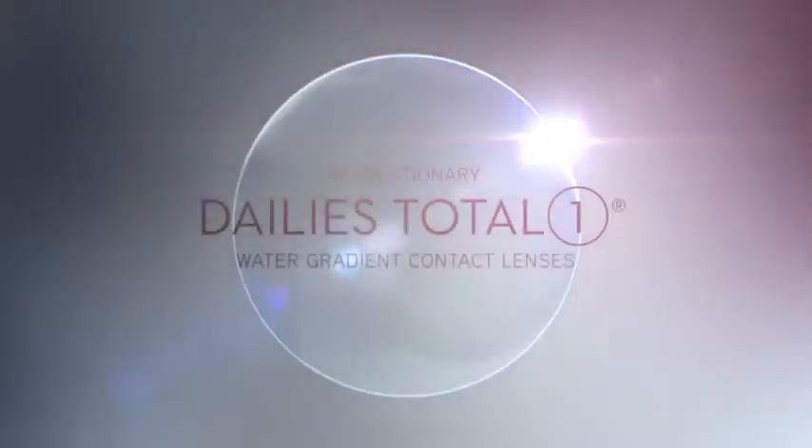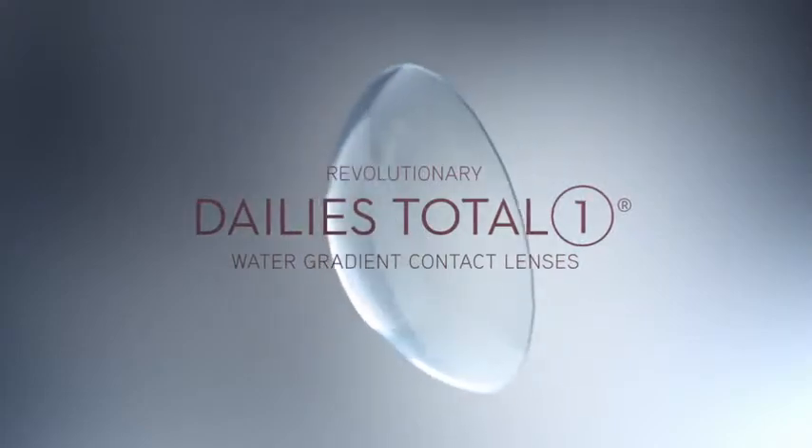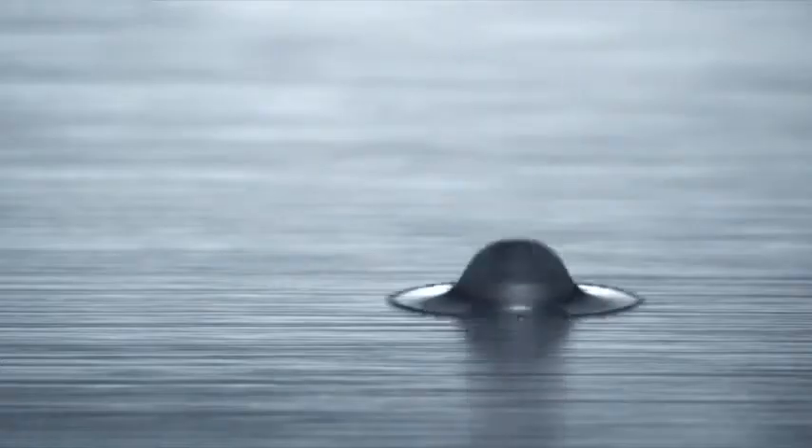Discover Dailies Total One Water Gradient Contact Lenses — the lens that is so comfortable it actually feels like nothing. Inspired by water, it's designed in a whole new way using a truly breakthrough technology. This is why Dailies Total One Water Gradient Contact Lenses feel silky smooth until the end of your day.